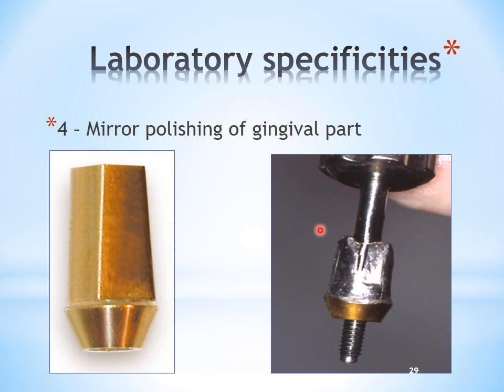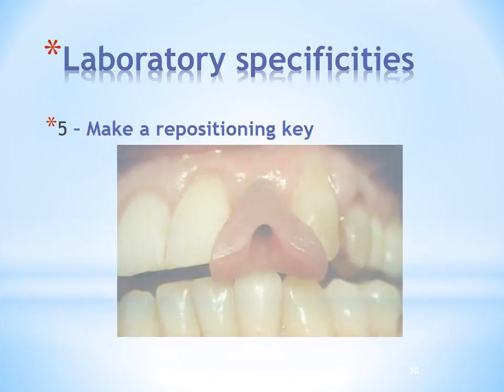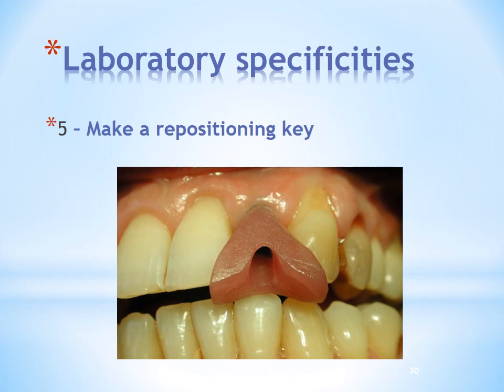Then selection of the abutment and preparation and finishing and polishing of the abutment in the laboratory.